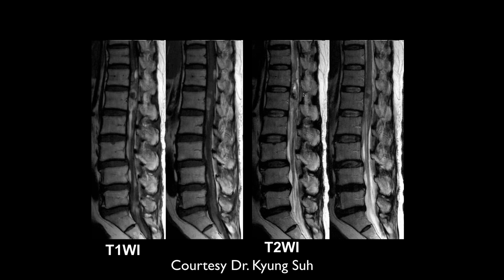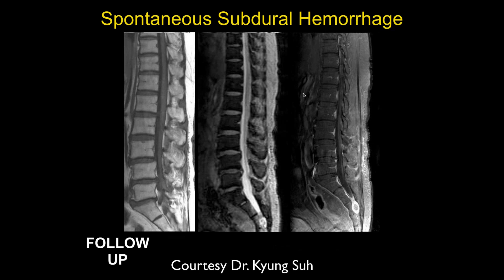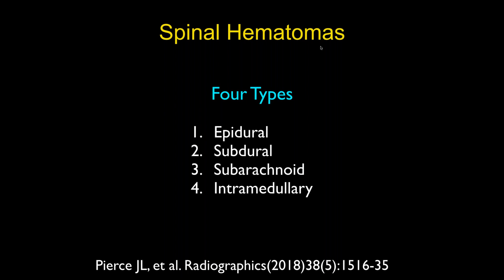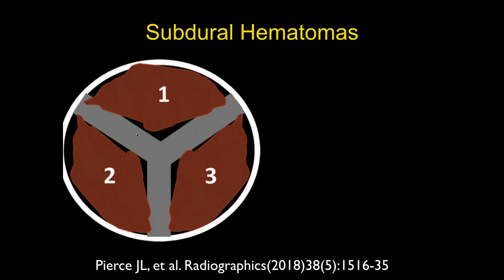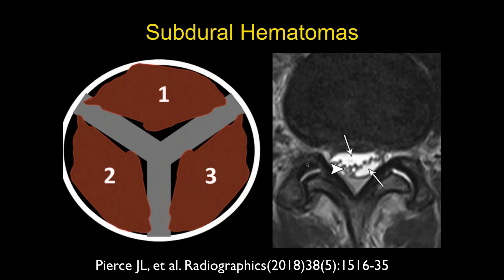This was a spontaneous subdural hematoma. For spinal hematomas, there are four types: epidural, subdural, subarachnoid, and intramedullary, involving different layers of the spine. With subdural hematomas you'll often get a triangular appearance where the blood compresses the thecal sac, resulting in a trefoil-type appearance. Here's just an example of a subdural hematoma.